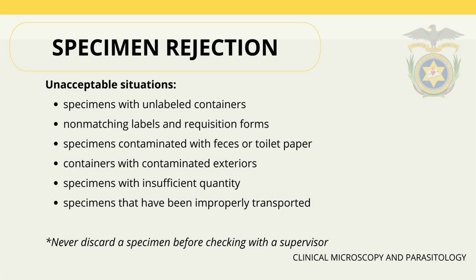Number 5, when the specimens have insufficient quantity. And lastly, when specimens have been improperly transported. But always take note to never discard a specimen before checking with a supervisor.